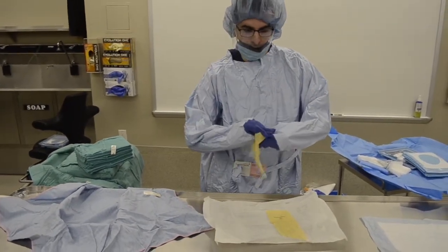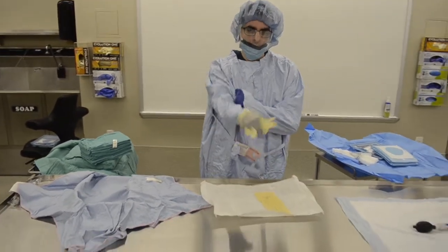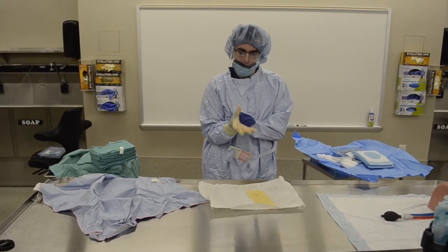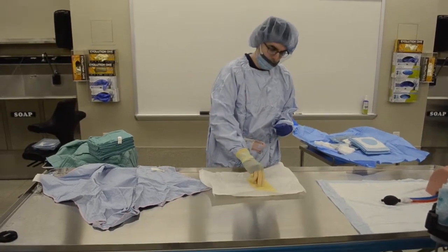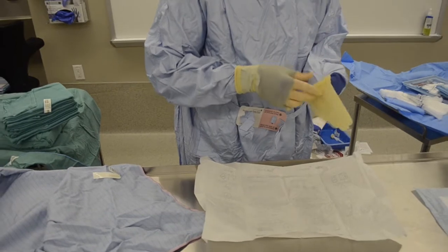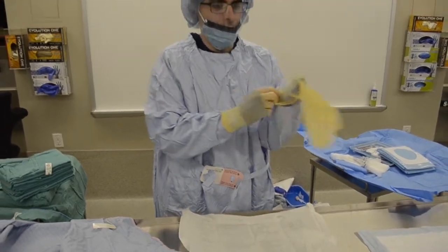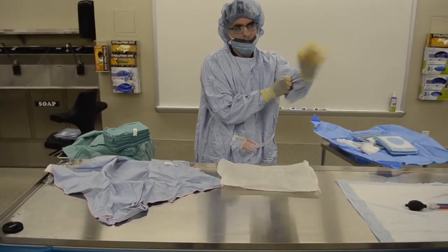You're going to put this hand inside and just slide it over, and then pull, and pull, until your fingers come out the other end. Now you're ready to lift up your other glove. Now I'm going to do the same thing. And then pull through.